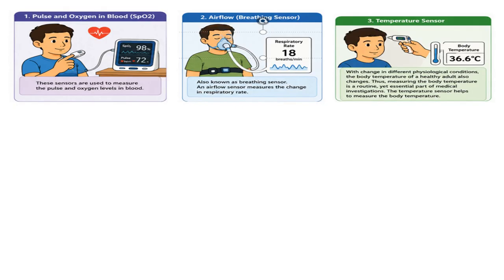Modern wearable temperature sensors can automatically send the readings to the healthcare systems for remote monitoring, and early detection of abnormal temperature changes helps the doctors diagnose illness quickly and provide appropriate treatment, improving patient safety and healthcare outcomes.